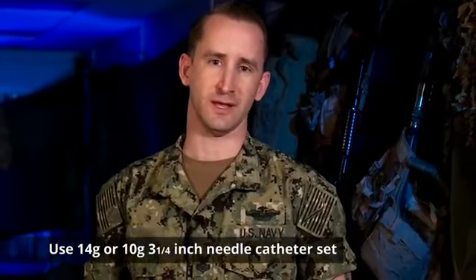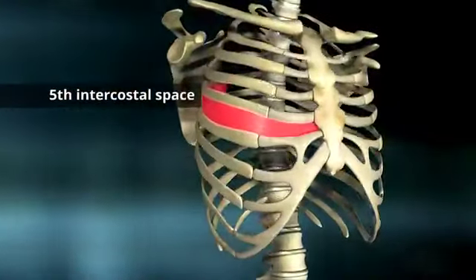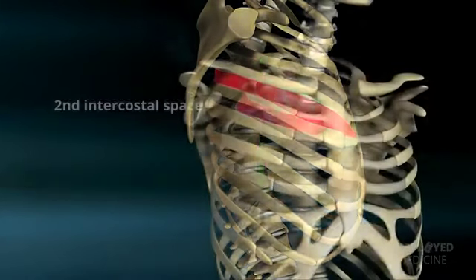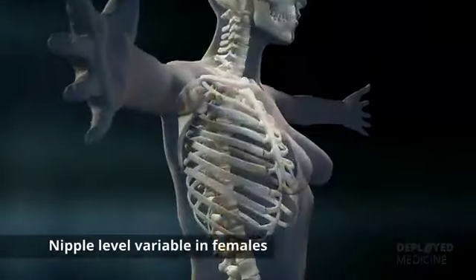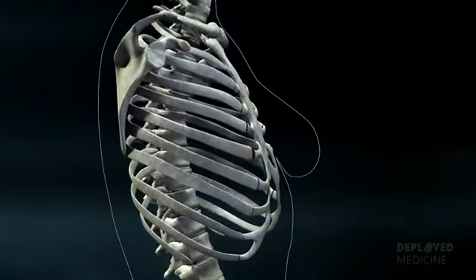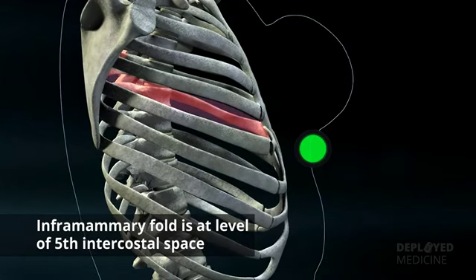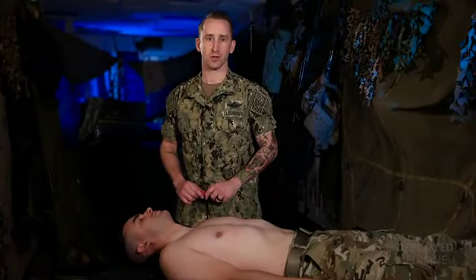The needle chest decompression is performed using a 14 or 10 gauge 3¼ inch needle catheter. There are two acceptable sites for the needle chest decompression: the 5th intercostal space on the anterior axillary line or the 2nd intercostal space at the midclavicular line. The nipple level is variable in females, but you can lift the breast and use the level of the inframammary fold. I'm going to demonstrate on the 2nd intercostal space, midclavicular line.